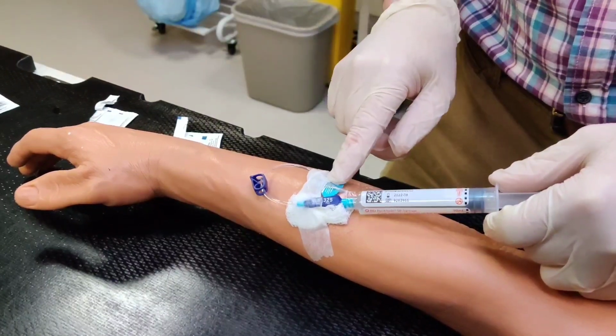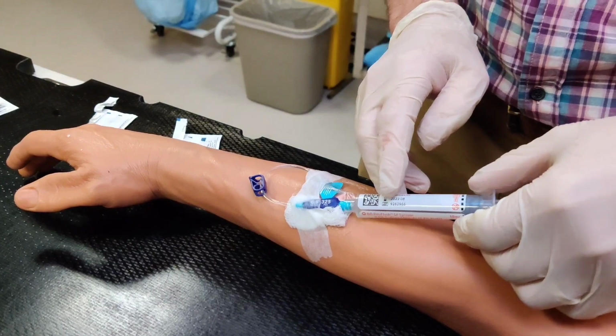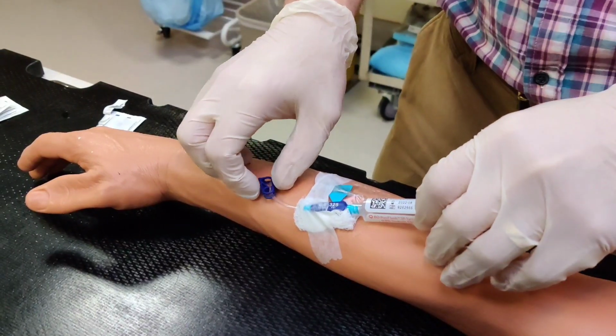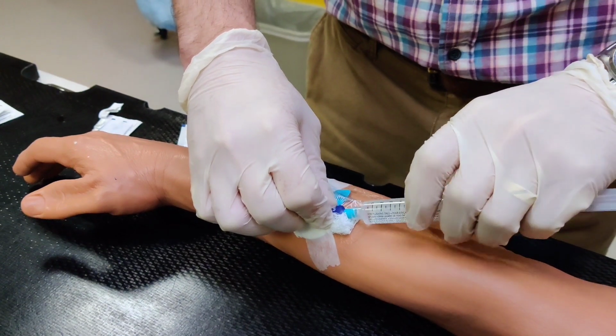Once I've seen that blood, then I can do a flush of the full 10 milliliters of saline into the IV line. So I would inject that in. Once that's done, I'm going to clamp the line again. I'm going to disconnect.